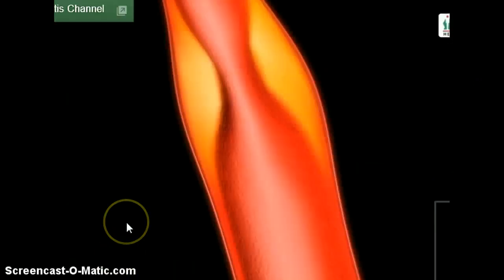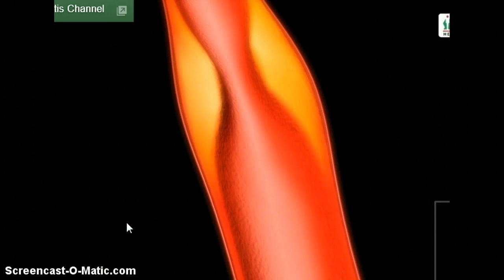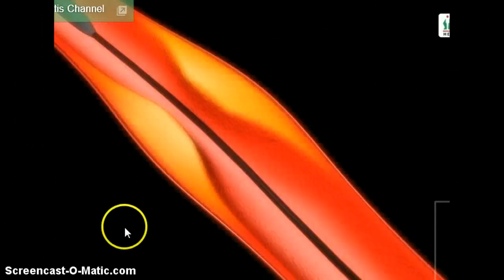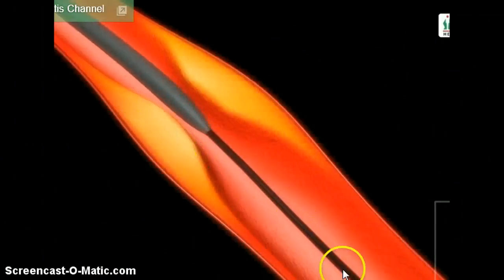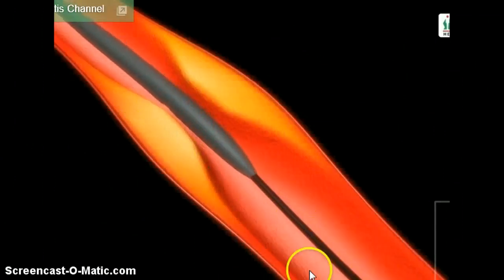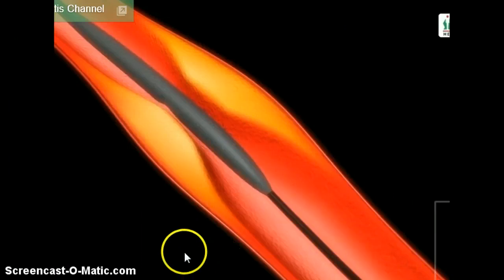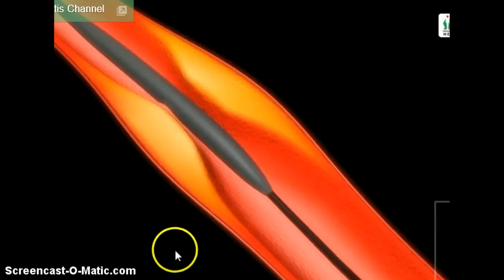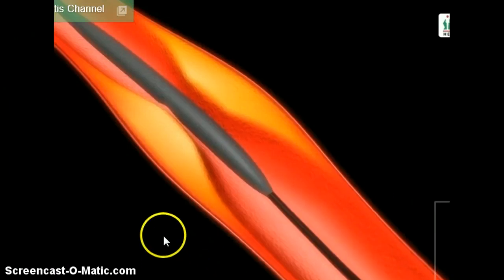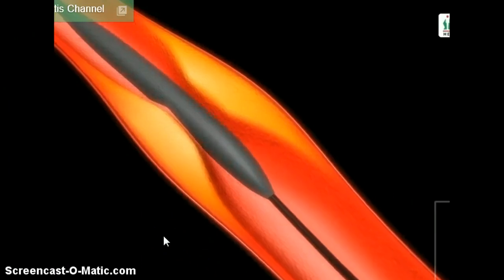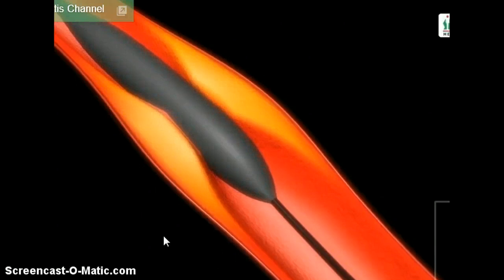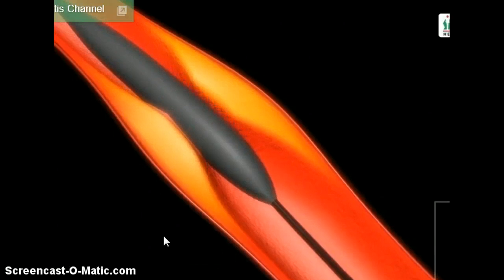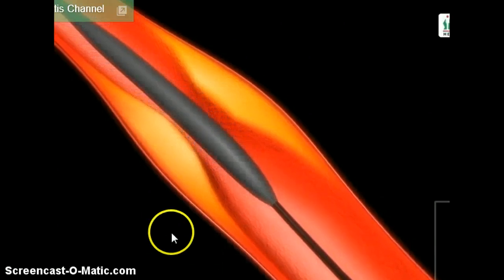Here is an animation showing the guide wire being threaded across the lesion. Here comes the balloon catheter over the top of the guide wire. Here the balloon is inflated with the endoflator.